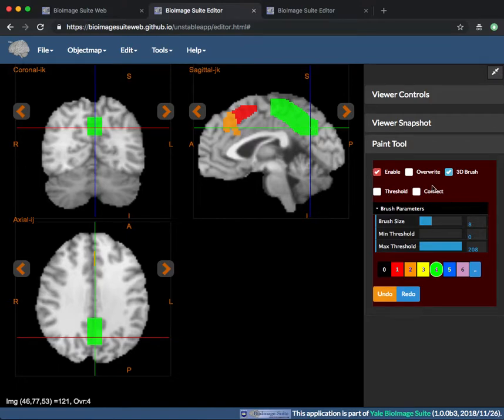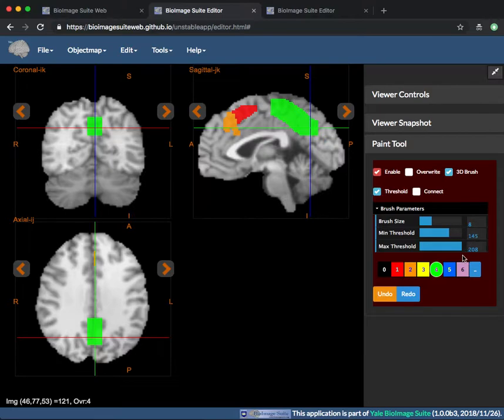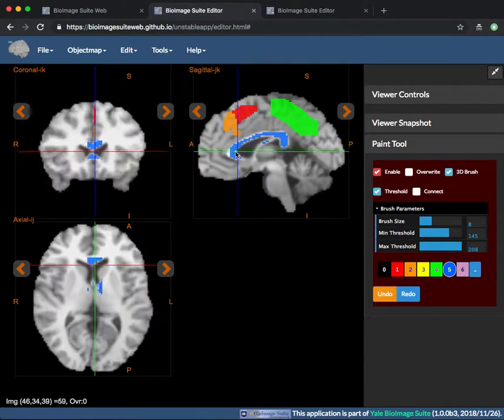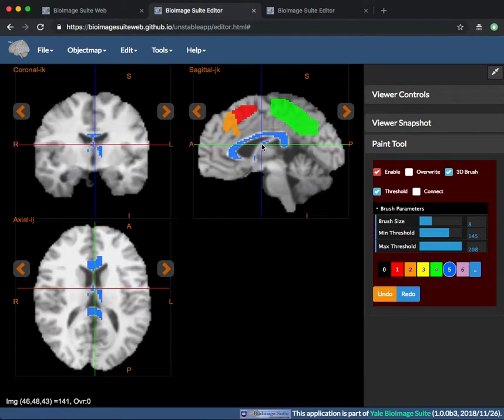When threshold is checked, painting will only occur if the underlying image intensity is between the min and max threshold.